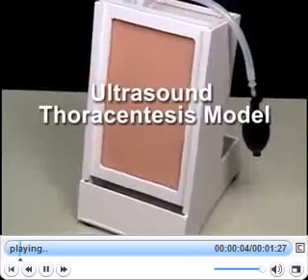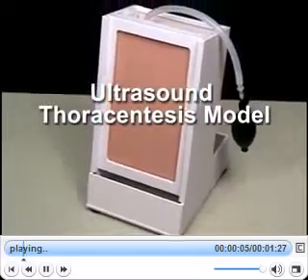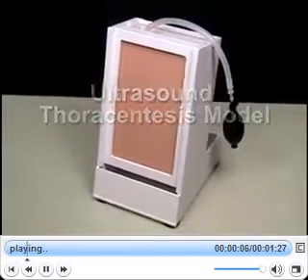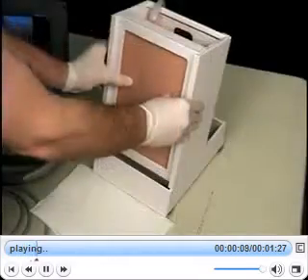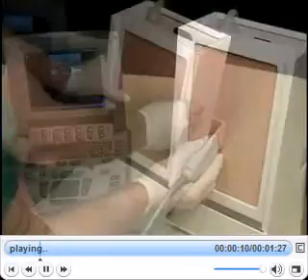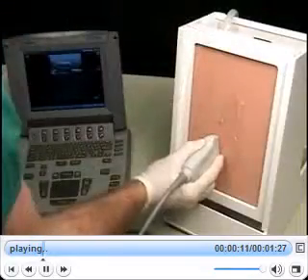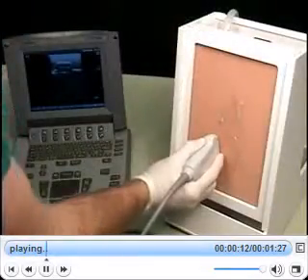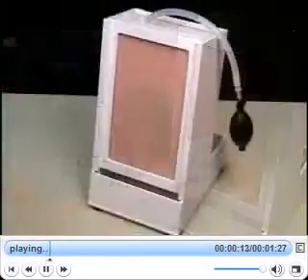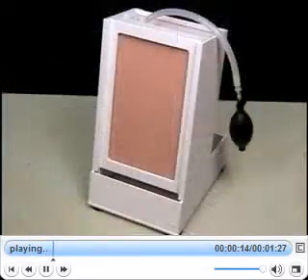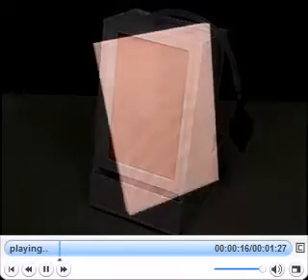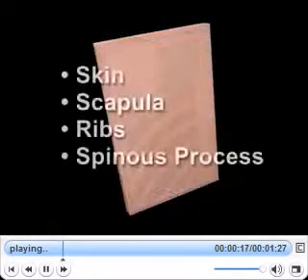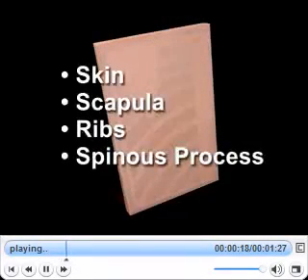Simulab's ultrasound thoracentesis model is anatomically correct, with landmarks that can be palpated and viewed under ultrasound. The simulated partial torso includes skin, scapula, ribs, and spinous process.